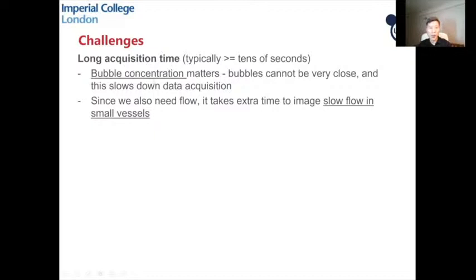Bubble concentration matters because we want to localize individual bubbles, so they can't be very close. If you use a lower concentration, it slows you down, because you need to accumulate a sufficient number of bubble signals. And since we need flow, it takes extra time to image slow flow in small vessels, because you have to wait until the small vessels are perfused with these agents.